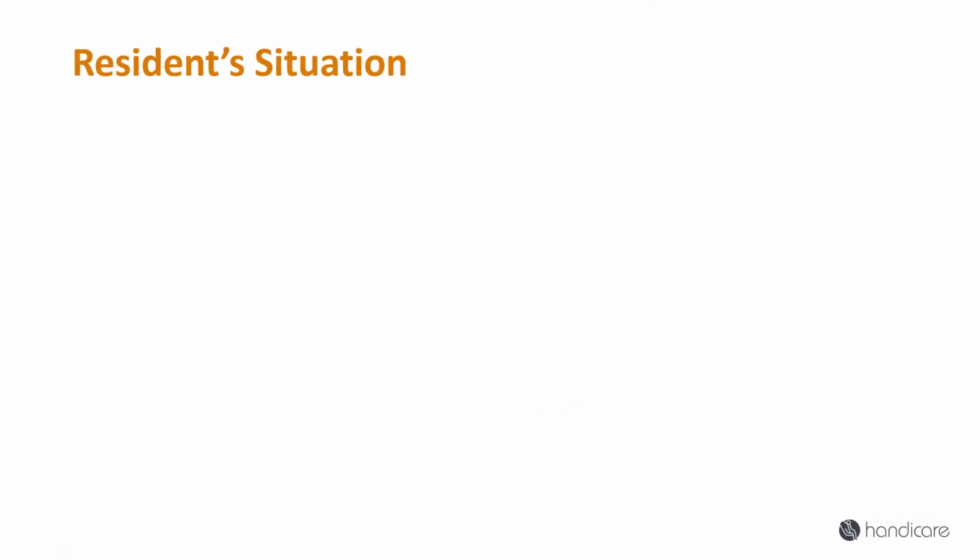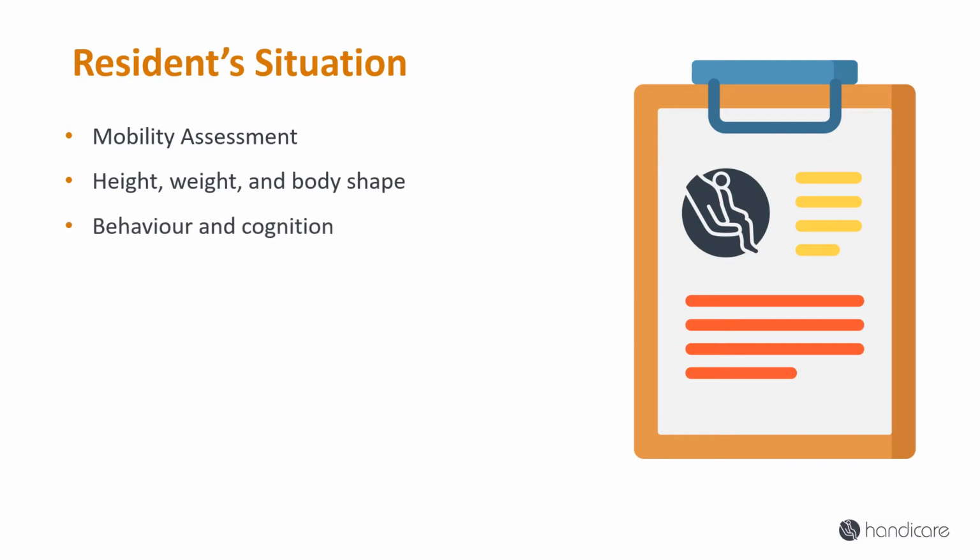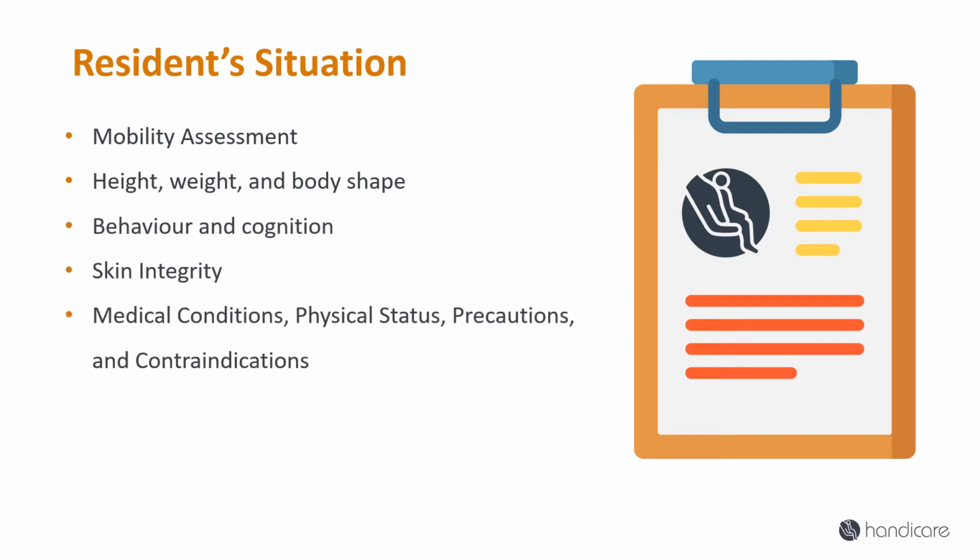During the initial assessment, the healthcare professional will perform a mobility assessment and determine if the resident is independent with their transfers, whether they require supervision or queuing with transfers, whether they require a 1 to 2 person assist with transfers, or whether the resident is partially weight-bearing and may require a sit-to-stand lift and sling, or if the resident is non-weight-bearing and requires a floor or ceiling lift and sling to safely transfer from one location to another.